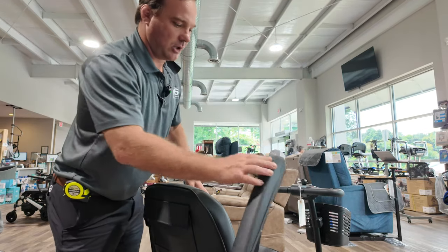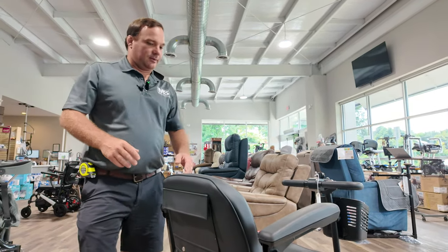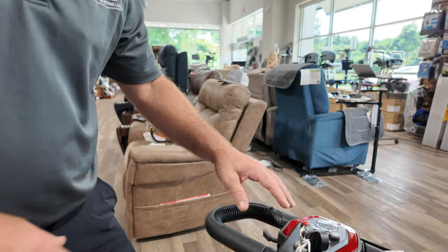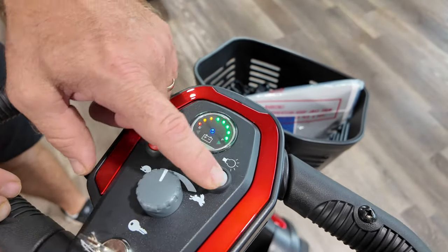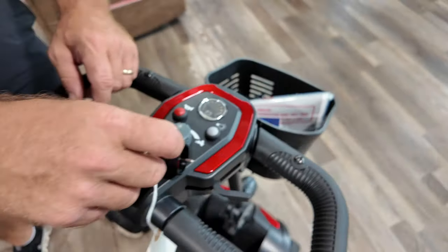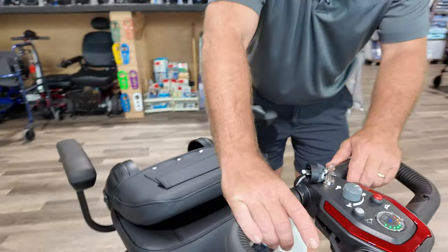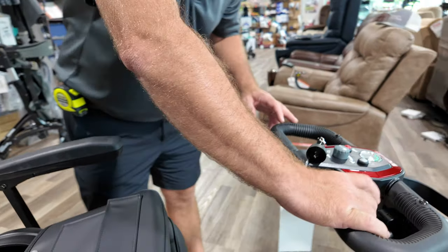The Roadster S4 is a portable disassembled scooter. It has a wraparound delta tiller with a simple dashboard featuring LED lights, a horn, a light switch, speed control, an on/off key, and forward and reverse. You can also operate it with one hand if needed.